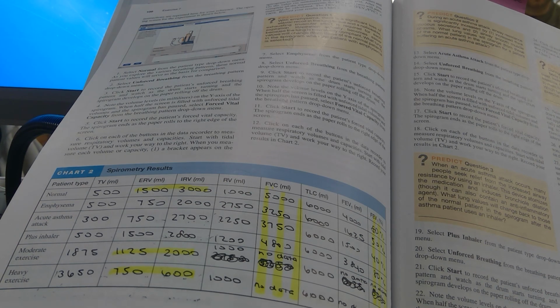If this FEV1% is less than 80%, it's obstructive. Then we had a patient with an asthma attack, and again, their FEV1% dropped below 80 significantly. It was cut in half. Then when the person used their inhaler, it helped improve matters.